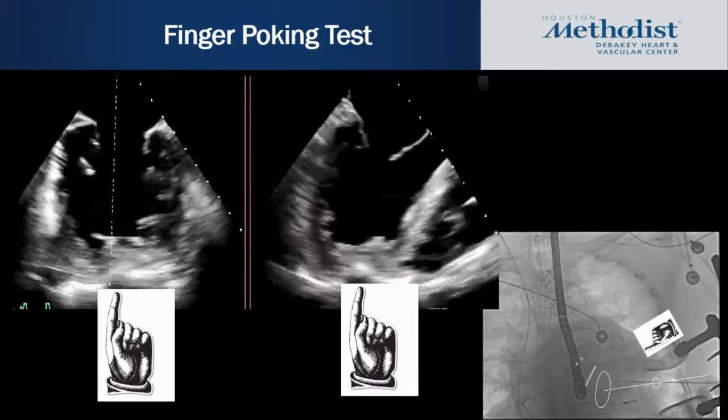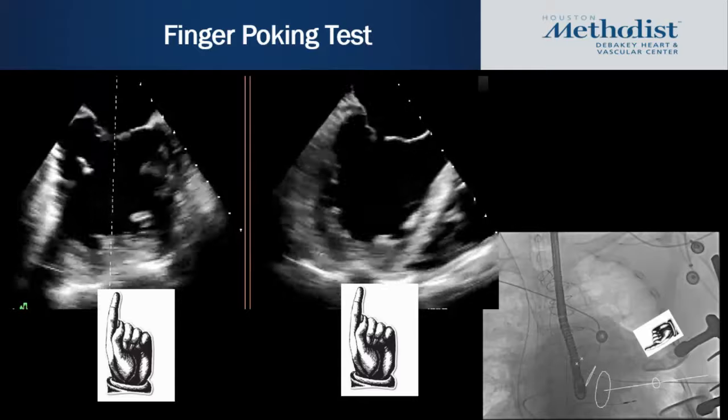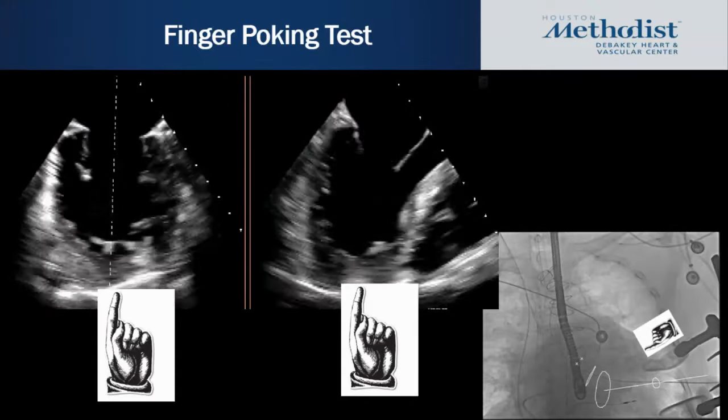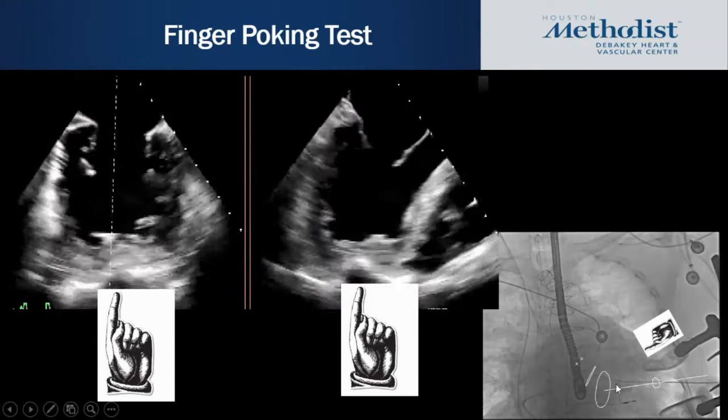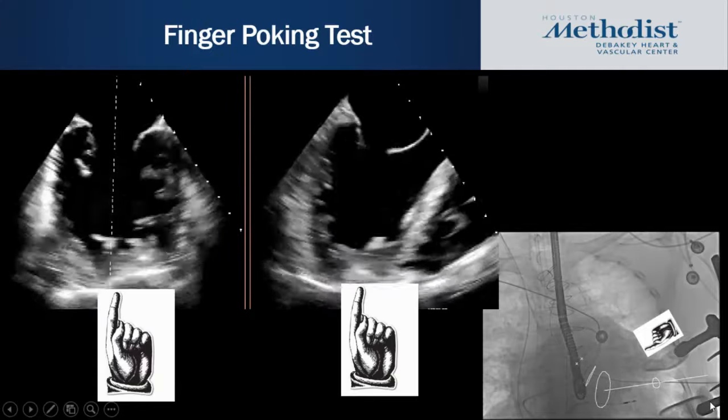This must have been Dr. Reardon. At the same time, we also use CT with CT markers on the fluoroscopy screen to provide further guidance into the optimal transapical puncture site.